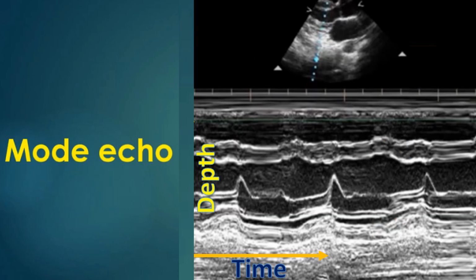The systolic and diastolic measurements are taken using computerized calipers in the echocardiograph, and the software package calculates the dimensions and ejection fractions. The fact that the interface between two different media produces the best echoes is demonstrated in the pattern of the interventricular septum. Both upper and lower margins are echo-dense, while the intervening tissue is less echo-dense. Vertical axis in this image is the depth and horizontal axis is the time.